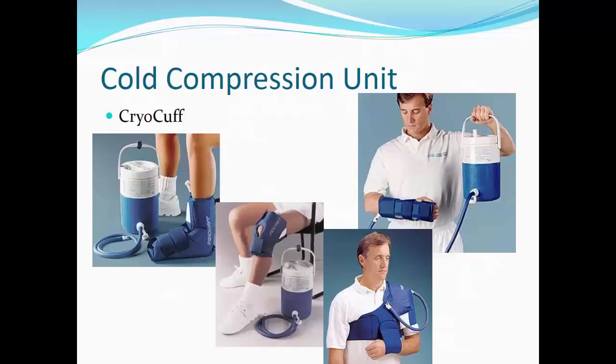For example, if the cooler is 20 inches above the cuff during filling, the applied compression will be approximately 35 millimeters of mercury. When the body heat warms the water within the compression device, it is rechilled simply by lowering the thermos. The one drawback of this unit is that the water does not circulate on its own, and it requires someone to elevate and lower the thermos to change the water within the compression unit.